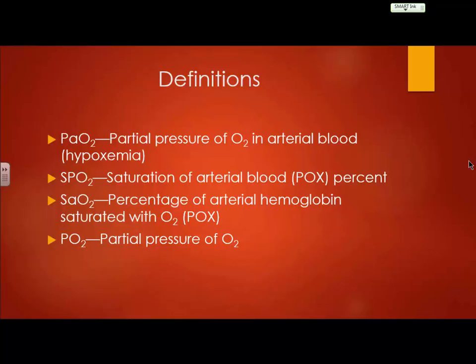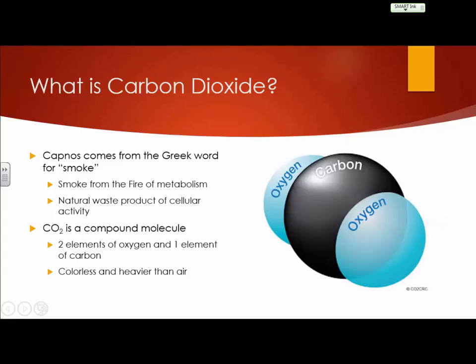What bearing does that have on us in the field? Not a lot, other than understanding what we're looking at and what we're working with, because we're not going to draw blood gases and adjust ventilatory settings based off of blood gases. Our main monitoring when it comes to this is going to be that end-tidal CO2.